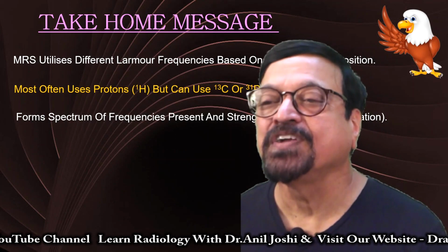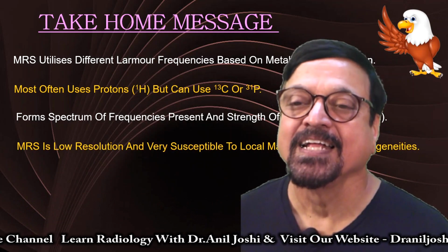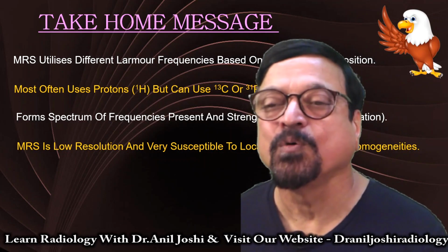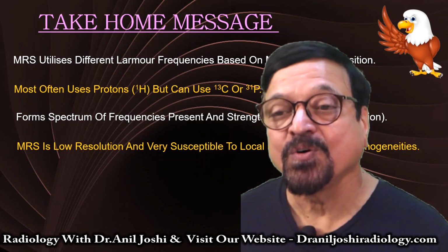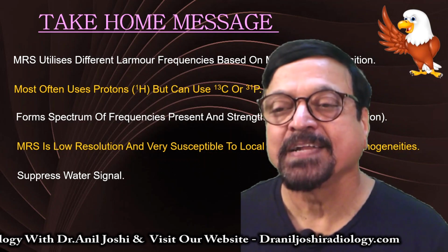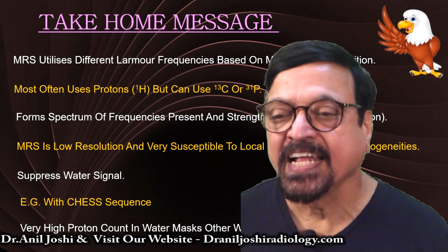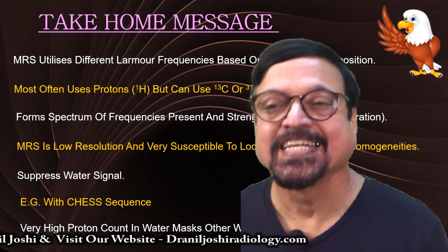It forms a spectrum of the frequencies present and the strength of the signals, that is concentrations. MRS is also low in resolution and very susceptible to local magnetic field inhomogeneities. So a homogeneous magnetic field, free of artifacts, is a prerequisite for MRS. Then it can suppress water signal. CHESS is the sequence used because we need to suppress water, and the very high proton content in water makes otherwise weaker signals hard to see.